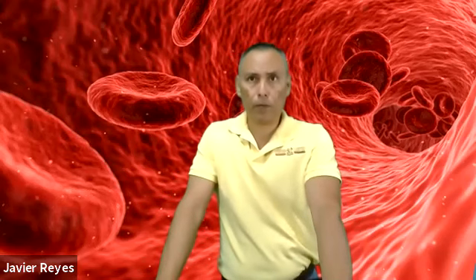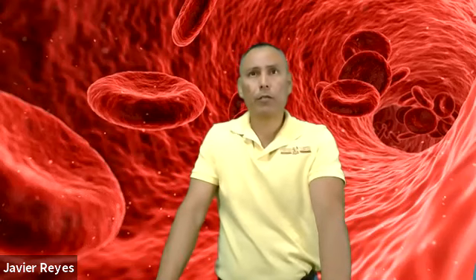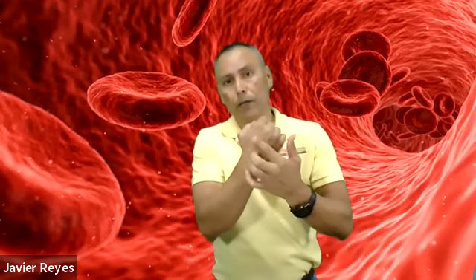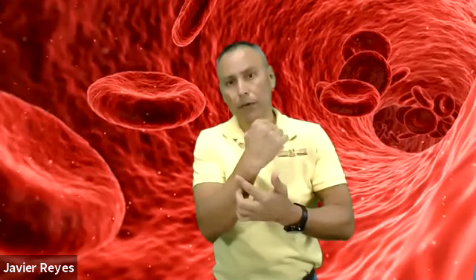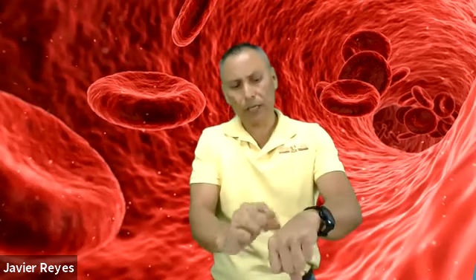The bevel penetrates a valve, preventing blood flow. This could happen usually on the veins of the hand, when you're palpating a vein and you feel or see little bumps on the vein. That is what we call a valve. This valve prevents blood from going back this way. Remember, venous flow is towards the heart, and if you see a little bump in a vein, that is a valve. You should avoid puncturing the vein at that site.